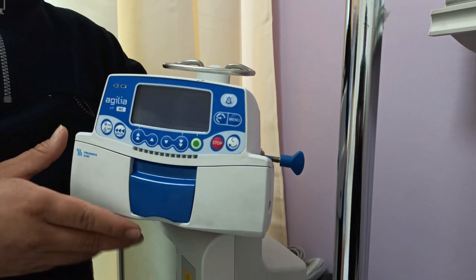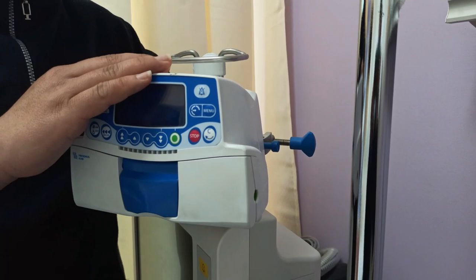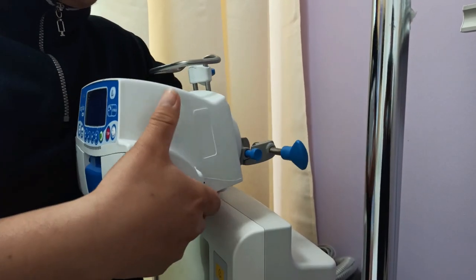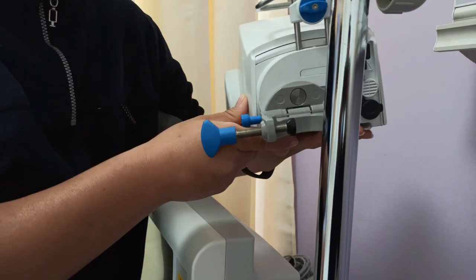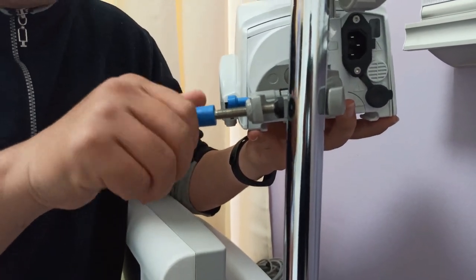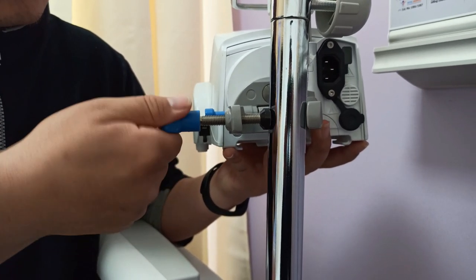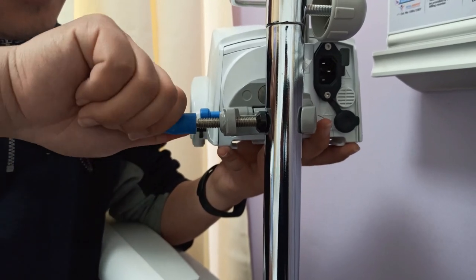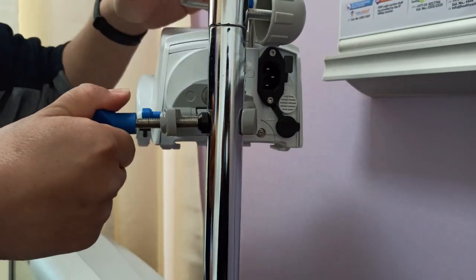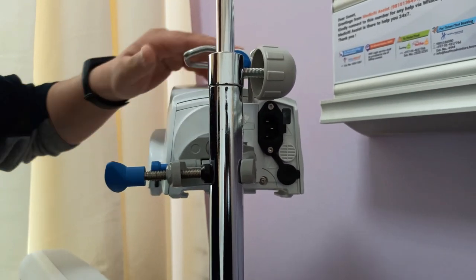Before operating the equipment, the first thing to do is clamp it to the IV pole. To do that, place it towards the IV pole, loosen up the screw, and once it is placed on the IV pole, tighten the screw until the equipment is no longer loose and is fixed in place.